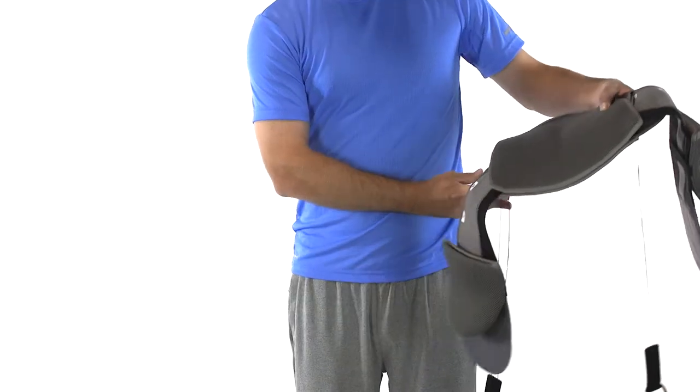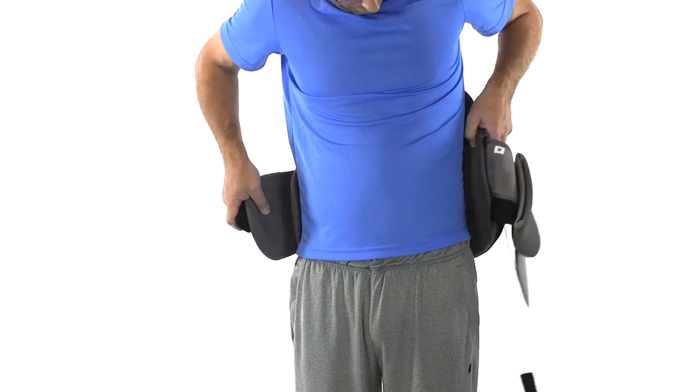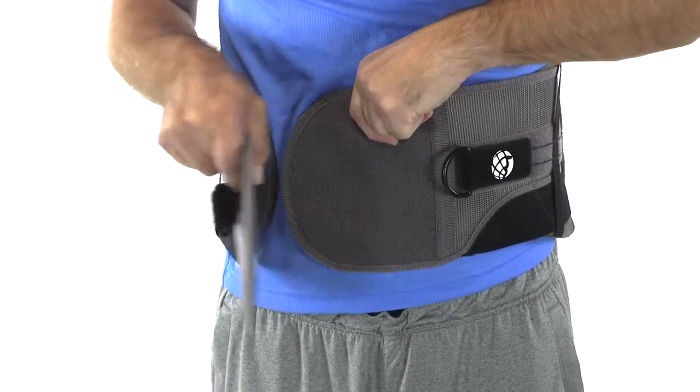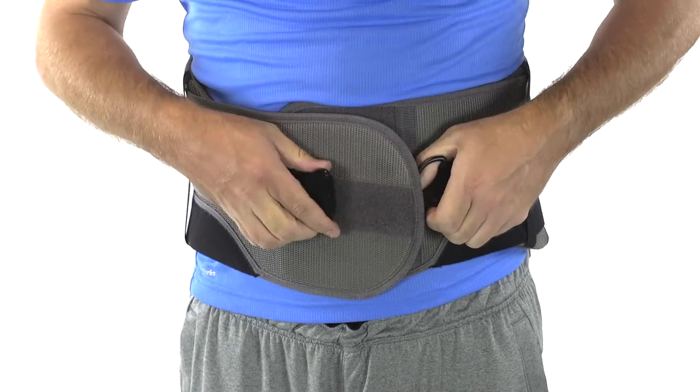While standing in an upright position, hold the side panels apart and center the back panel of the device along the spine just above the tailbone. Wrap the left side panel to the front to position the front panel, then wrap the right side panel onto the top of the left side panel to close.